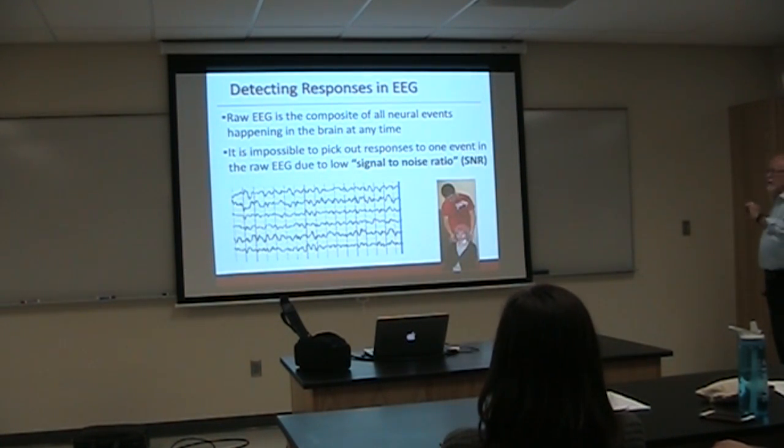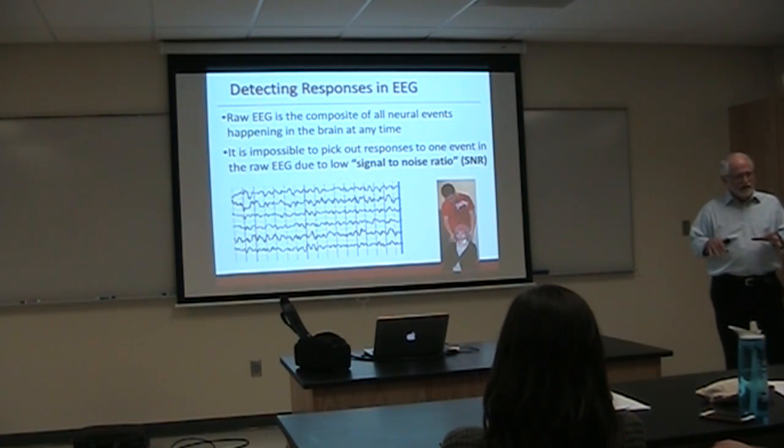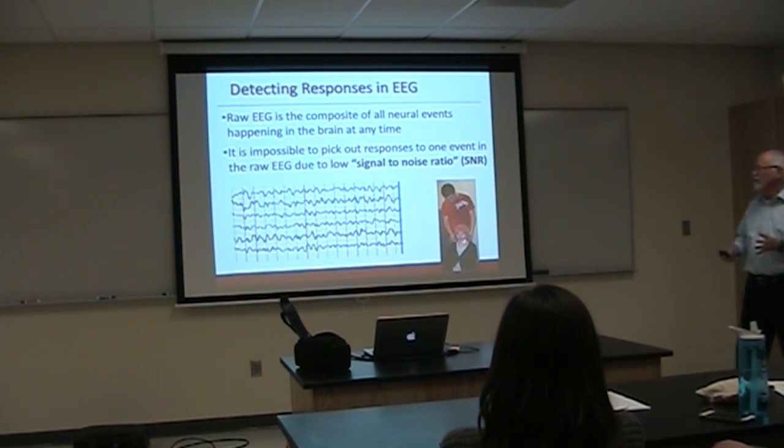Okay, so remember that the raw EEG is picking up all of the neural events that are happening at that moment in time in that region of the brain.